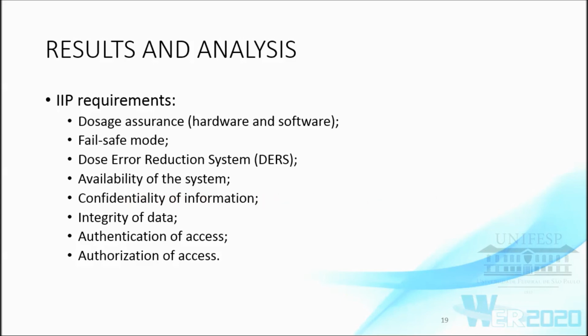The confidentiality of information. The data must be knowable to only the intended parts. The integrity of data. The data cannot be undetectably altered. The authentication of access. That is, only the authorized parties or components should be able to act. And the authorization of access. That is, certain authorized actions must be verified before execution.